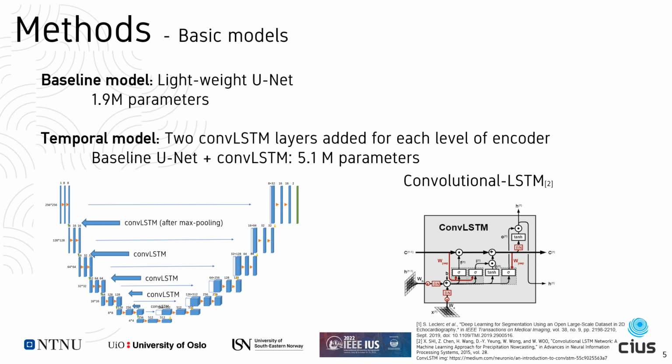Due to previous studies, U-shaped convolutional neural networks with skip connections outperform in ultrasound segmentation tasks. On the same dataset, a more complex UNet achieved better evaluation metrics. However, our objective is to exploit the temporal information in ultrasound recordings, and we want a compromise between speed and accuracy. Therefore, we simply used a lightweight UNet which has only 1.9 million parameters, which can run in real time and has very similar performance to heavier ones.